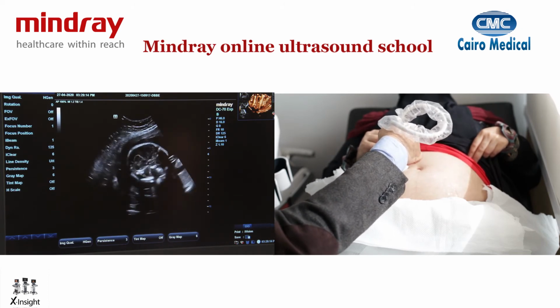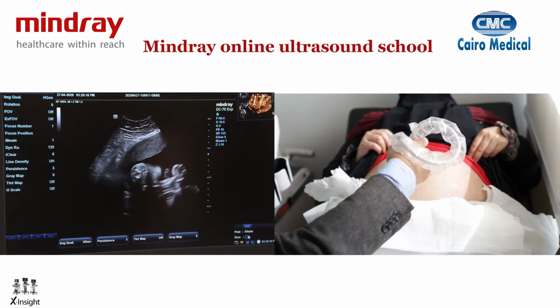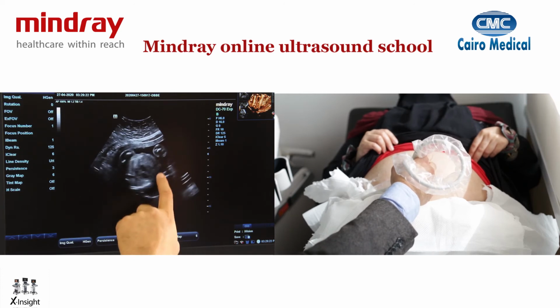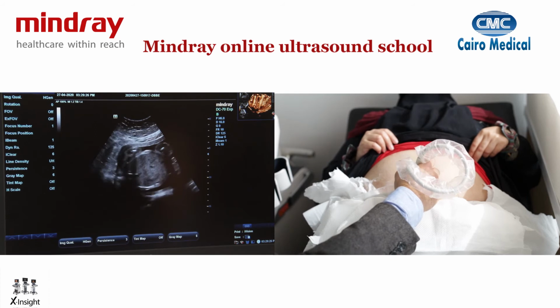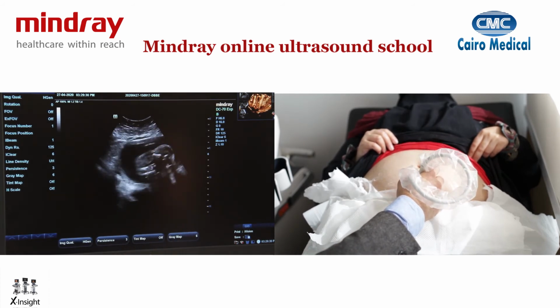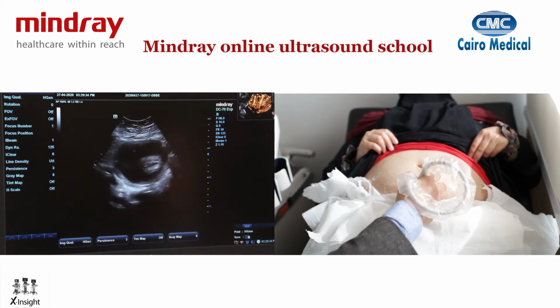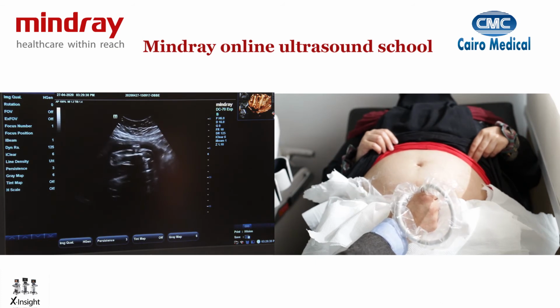I'm going to sweep across the whole baby's body now, so I'm going to see below that the fetal neck, and then below it I'm going to be seeing the view of the chest where I can see 4 chambers of the heart and the 2 lungs. Below it I'm going to be seeing the stomach, and if I keep sweeping down I will see the iliac bone, and if I rotate my probe at a 90 degrees angle, then I will be seeing the femur. So that's the easiest way to get the fetal biometry.